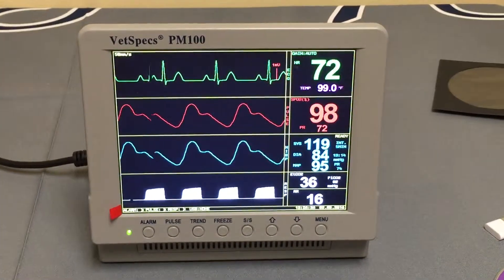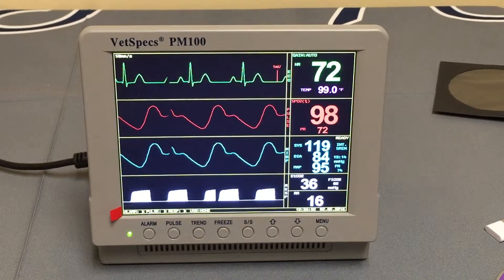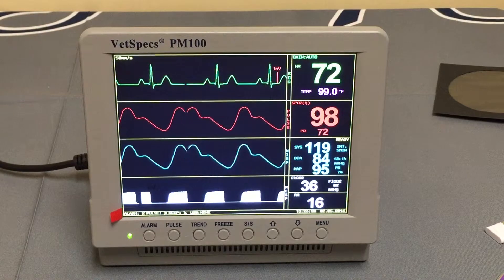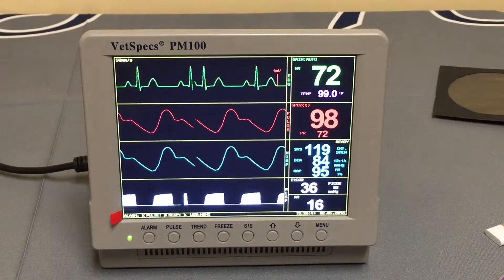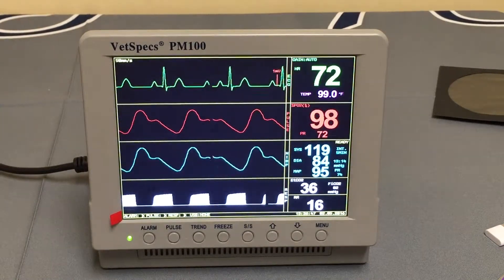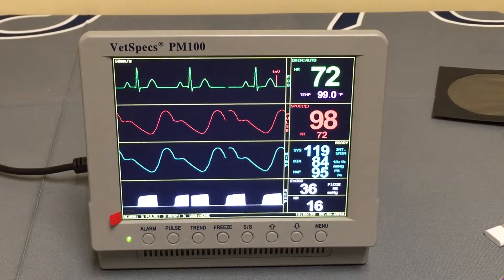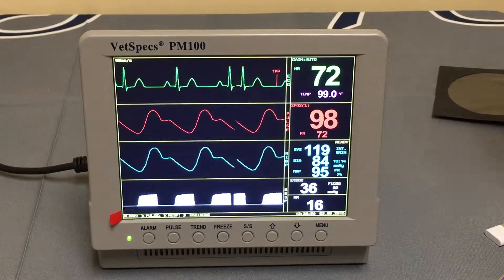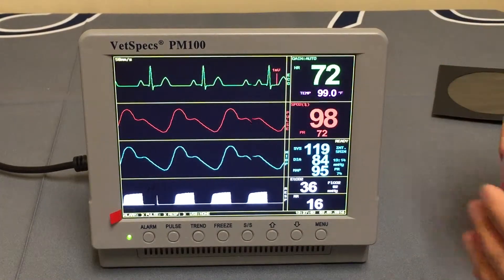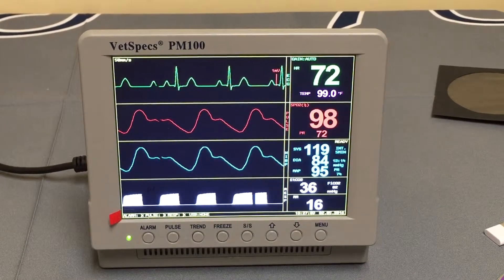We are going to move on to the data saving feature on the VetSpecs PM100. In my personal opinion, VetSpecs has stayed consistent in trying to make a surgical monitor that is as friendly and easy to use as possible without losing any of the vital information that you might need. That simplicity has carried over from the ease of use on the monitor to the data saving aspects as well.